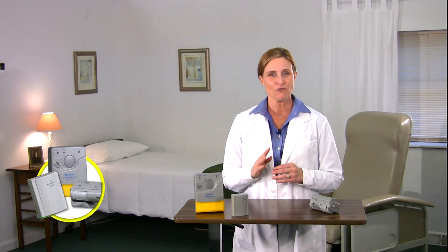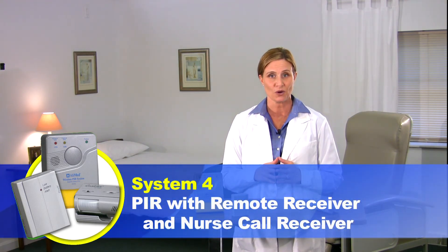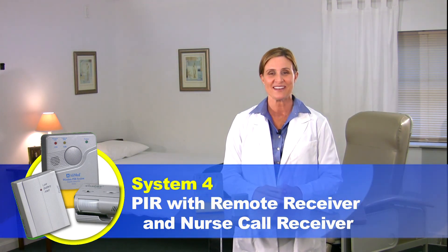You've just seen video 4 of the PIR motion sensor alarm systems featuring System 4, bed alarm with remote receiver and nurse call receiver. If you would like to learn about any of the other three PIR alarm systems, please see the separate instructional video for each. I'm Heidi Young for Alimed — thank you for viewing.